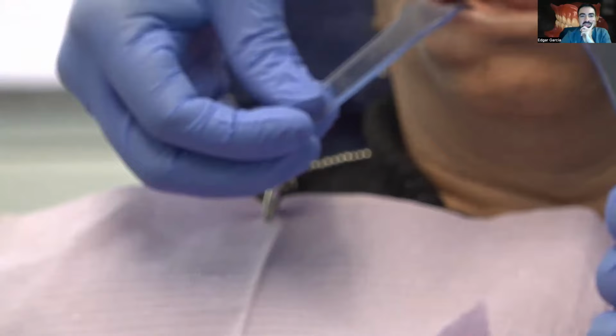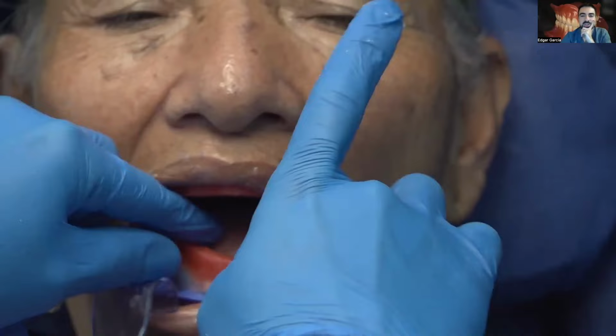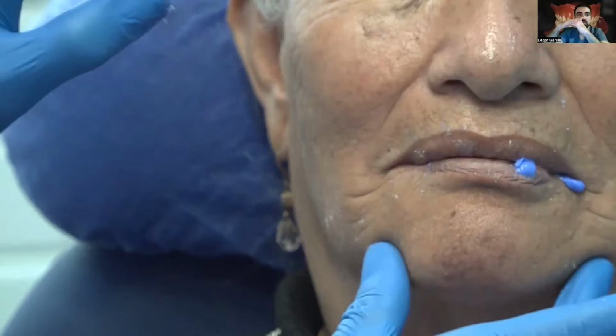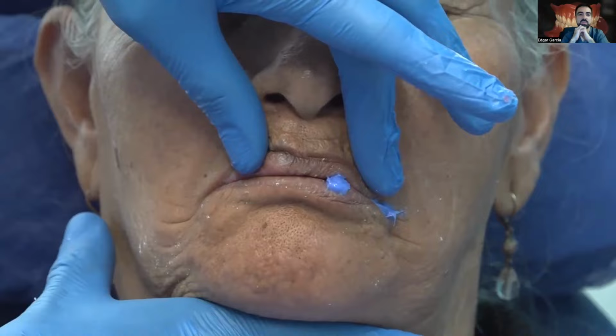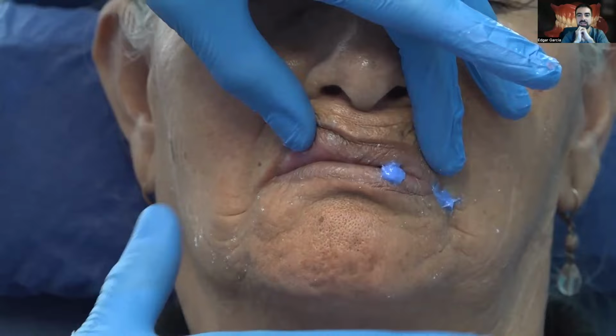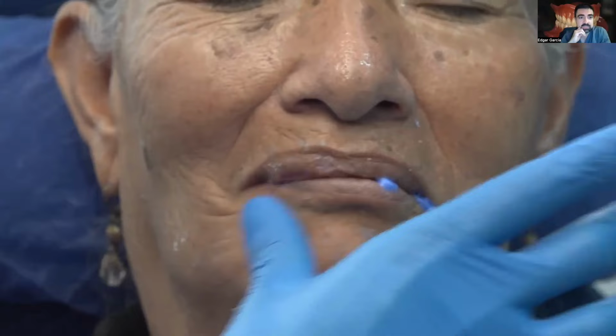So I put the tray in. I ask them to remove the retractors, move the tongue from side to side, to swallow, to maintain occluding. And I ask the patient to push with the tongue towards the palate. The posterior part. They're pushing with the tip of the tongue against the palate, correct? Exactly. That's why I say I think these steps are super easy.